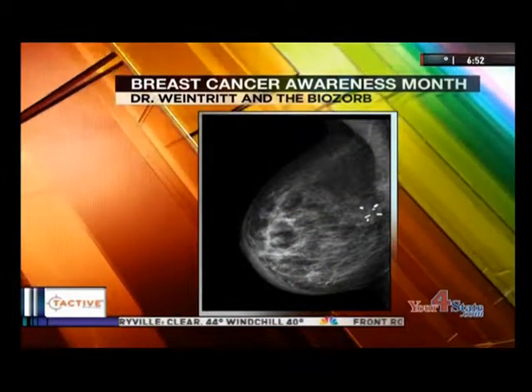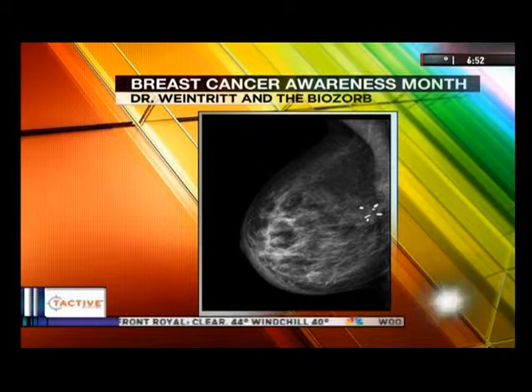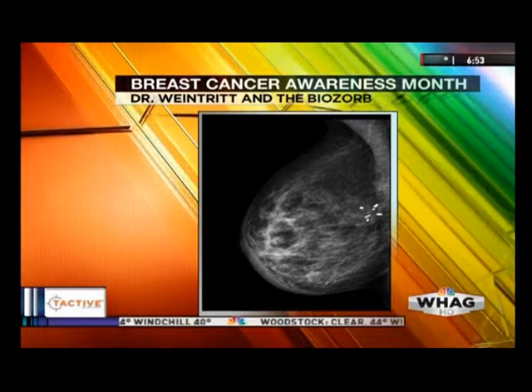What happens over time is the absorbable part obviously goes away, and the markers will remain, both, again, for the targeting of the radiation and for the monitoring afterwards. And studies have shown no complications in regards to issues related to the surgery that are specific to the device in any way.